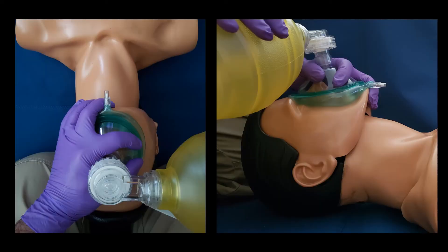With our EC clamp in place, we are ready to do a head tilt chin lift to open the airway of the patient. Opening the airway is a necessary component of effective ventilation. If you were to look up at the ceiling right now and gently raise your chin in that direction, you can actually feel your own airway open up — and that is what we are seeking to do with the patient with a head tilt chin lift.